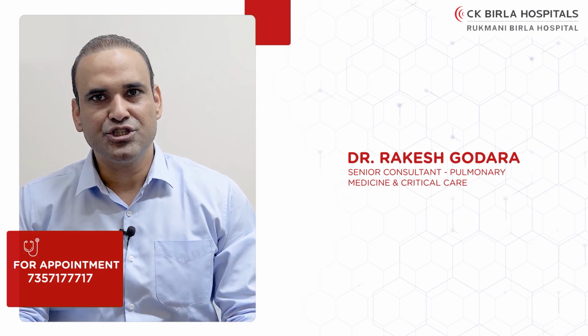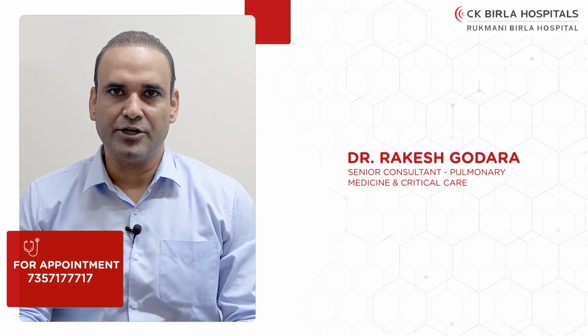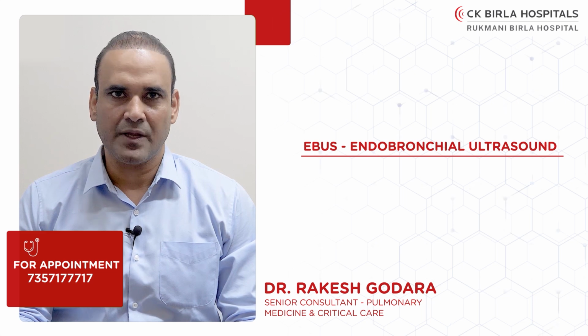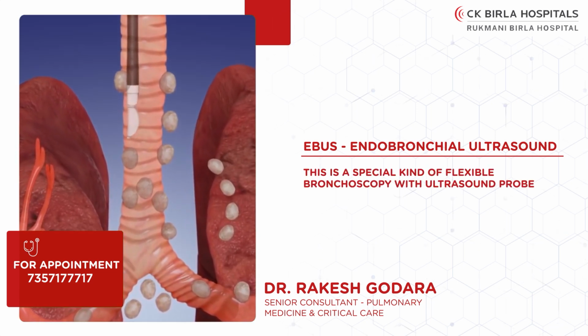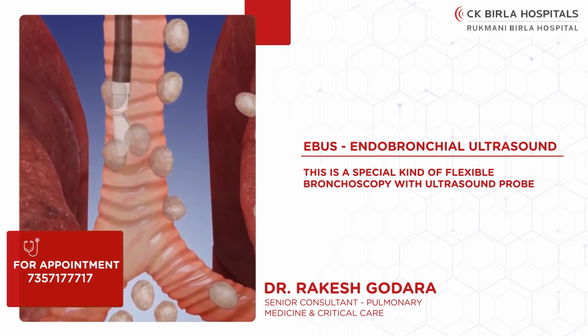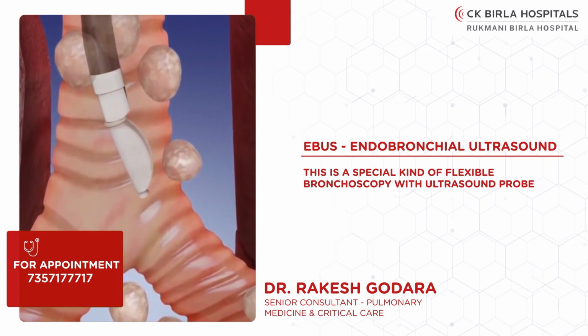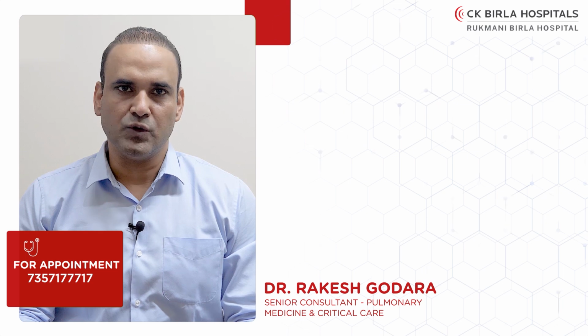If we see, there is a big change respiratory medicine has witnessed in the last decade: the introduction of EBUS, that is the Endobronchial Ultrasound. This is a special kind of flexible bronchoscope with an ultrasound probe at the tip of the scope, and this opens a whole new world of diagnostic possibility endoscopically, which was earlier not possible at all. So we will try to understand what the EBUS bronchoscope is.